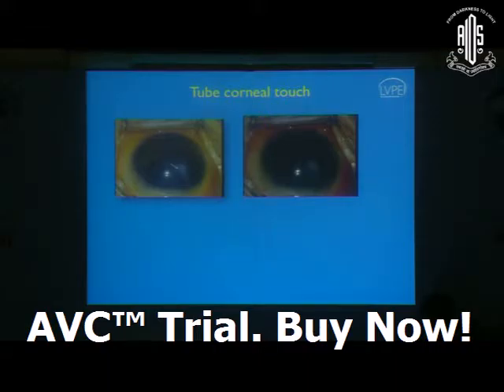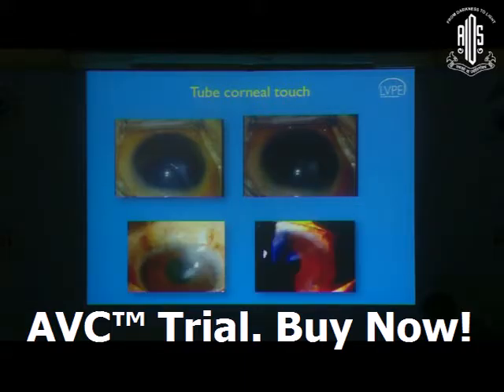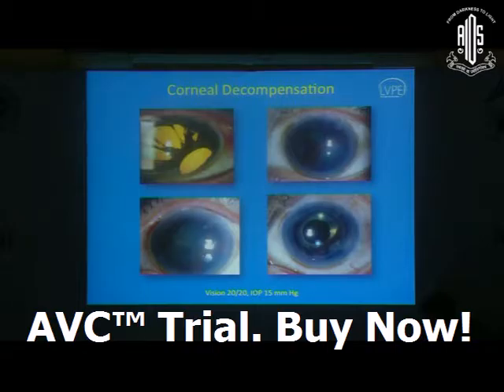So because in children, whatever you do, this eye rubbing is something that you cannot completely avoid. This patient required a tube trimming. It's quite easy to do that if you have this micro forceps and a micro scissors, you can go and trim it. Corneal decompensation, again, a very important lesson for us to learn.